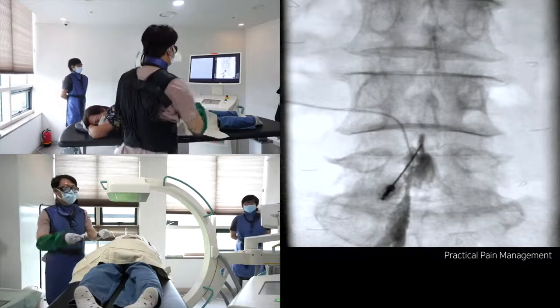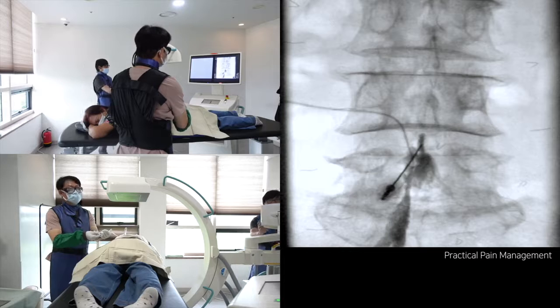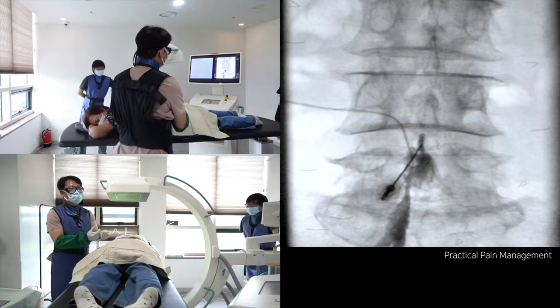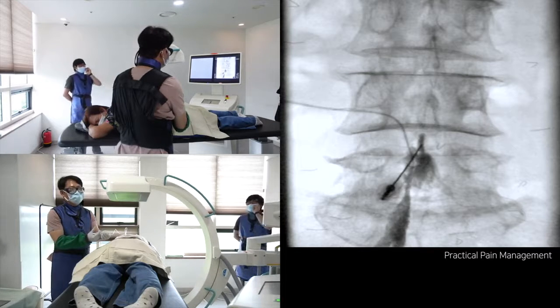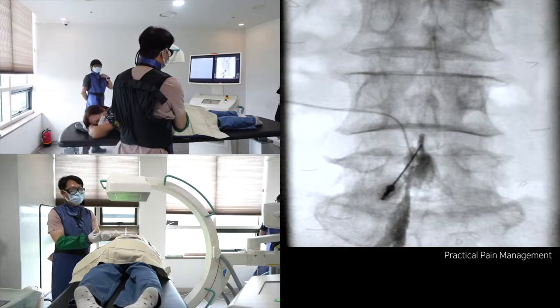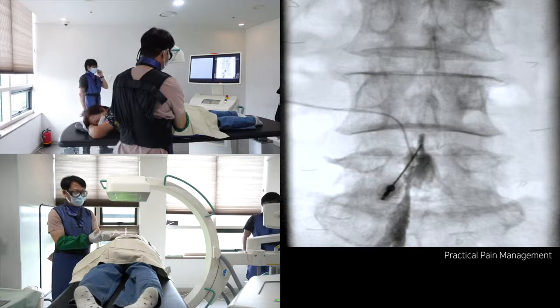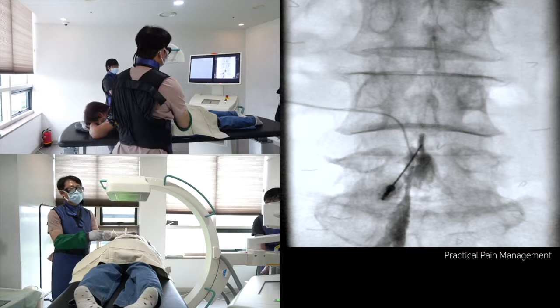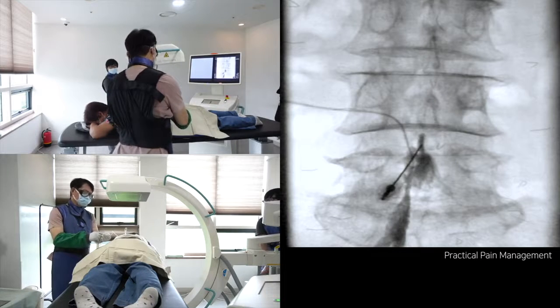The main indication of the interlaminar epidural steroid injection is as the first injection approach for central low back, suggesting discogenic pain. I prefer the perisagittal approach if there is an asymmetric disc protrusion and unilateral radicular pain or back pain.